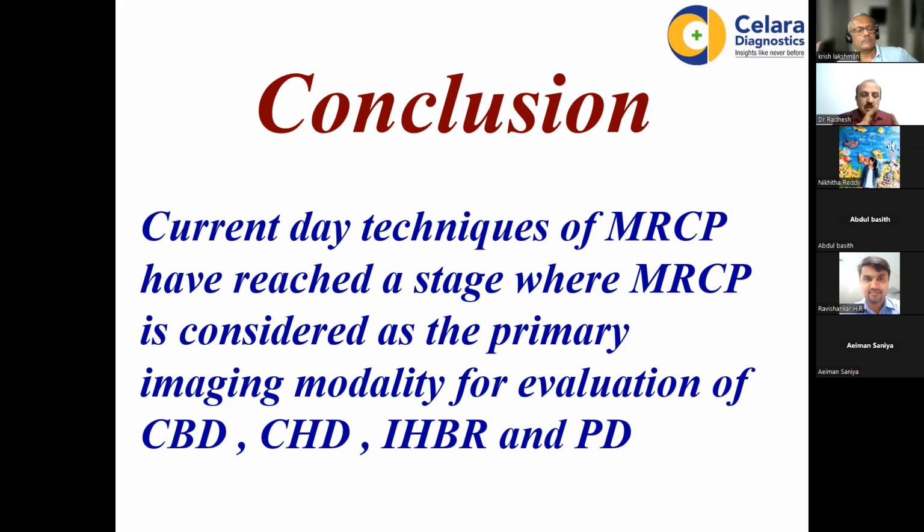Next, the commonly asked question. Now, there is a hip replacement, shoulder replacement, knee replacement. Are they contraindications for MRCP? No, they are not contraindications. Intramedullary nail is not a contraindication. Cardiac valves, current day valves, are not a contraindication.